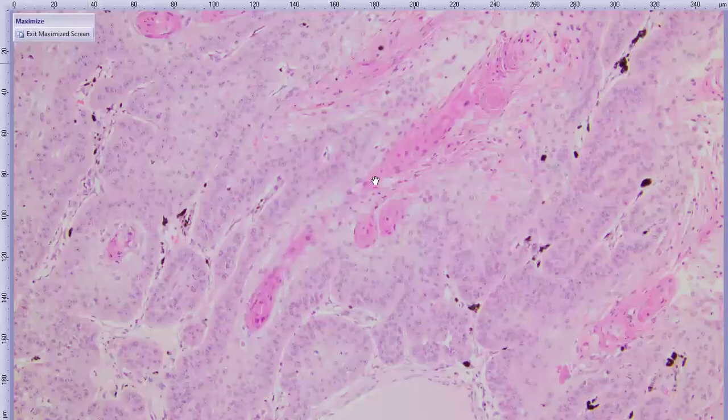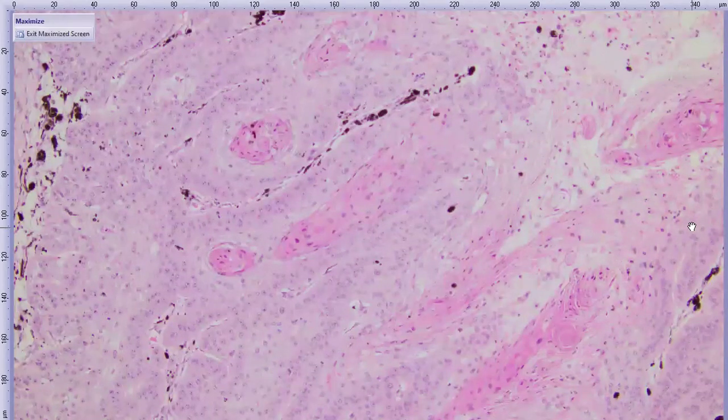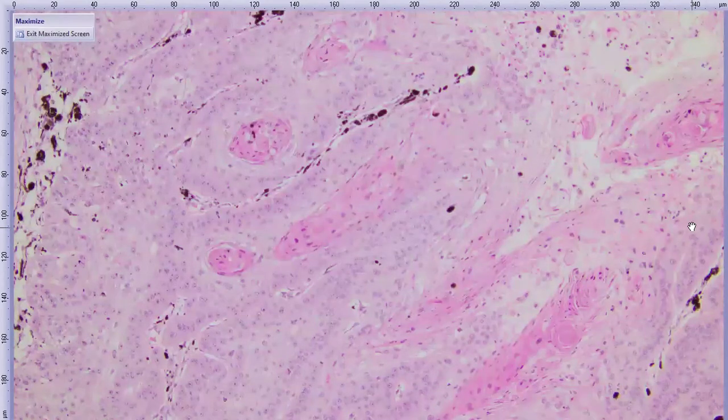And then in many lobules in the middle, we progress to these lamellated, compact layers of keratin, which oftentimes form these cute little nests in the middle of these lobules. They are referred to as keratin pearls. So we have an epithelial neoplasm that has a squamous differentiation. So this is a squamous cell carcinoma. A pretty classic diagnosis.